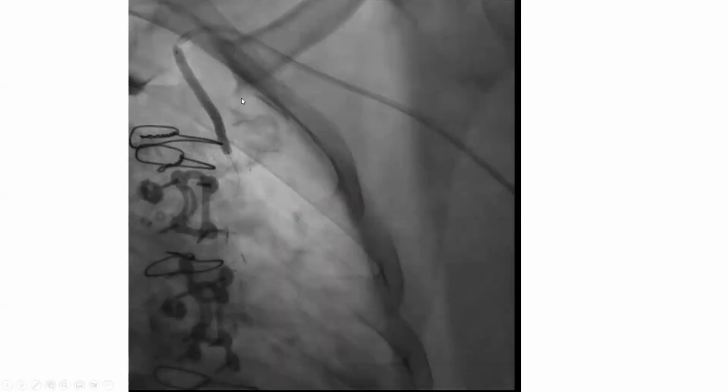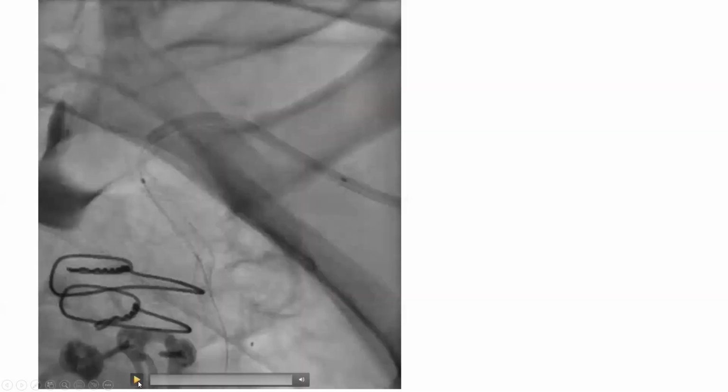So all we did, without any further contrast, was bring a long stent, a 3.5 by 38 millimeter stent. We covered the ostium, and we expected this to seal any further antegrade dissection more distally in the LIMA, or dissections into the subclavian, proximally or distally. And indeed, that's what happened.